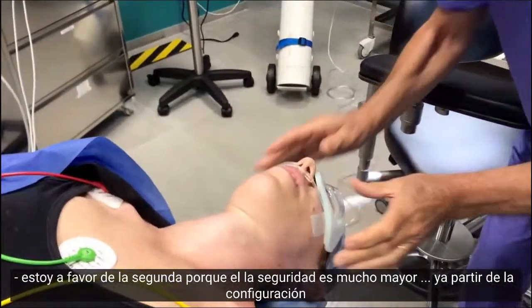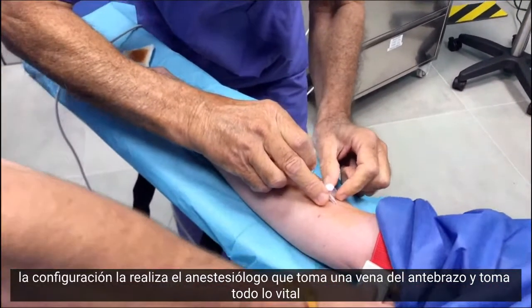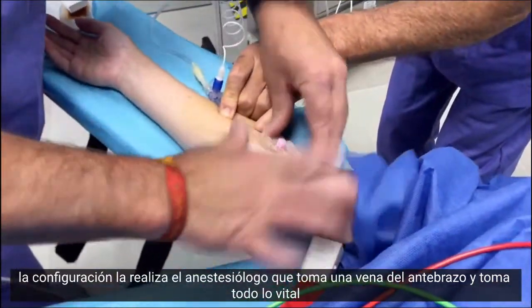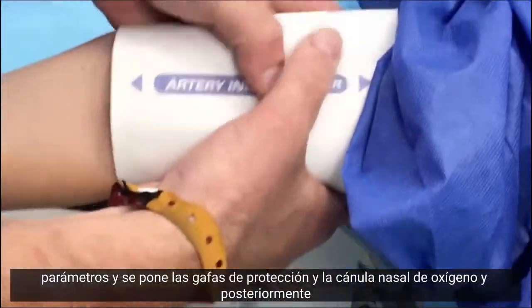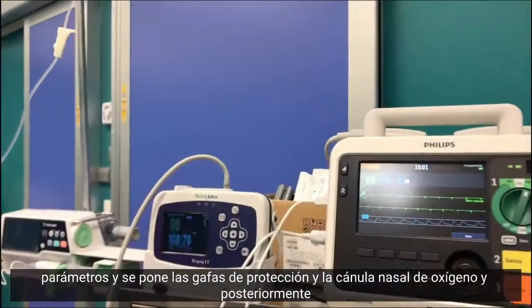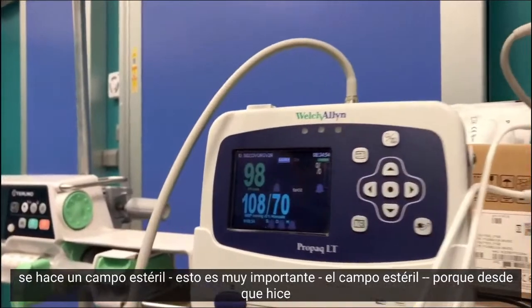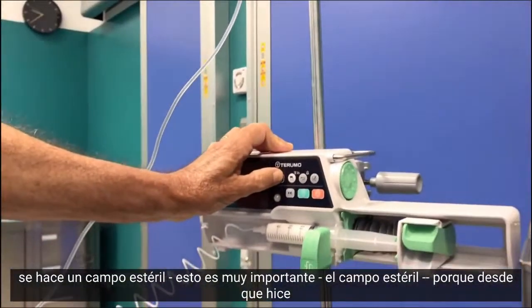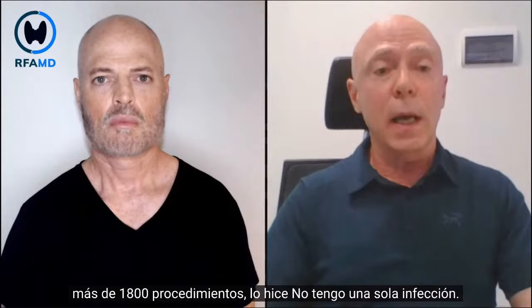Starting from the setup. The setup is made by the anesthesiologist, who takes a forearm vein and takes all vital parameters and puts on the protecting goggles and the nasal oxygen cannula, and thereafter a sterile field is made. This is very important, a sterile field, because since I did more than 1,800 procedures, I didn't have any single infection.